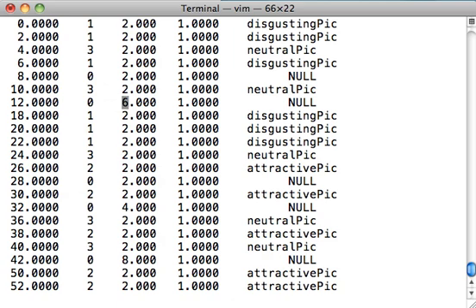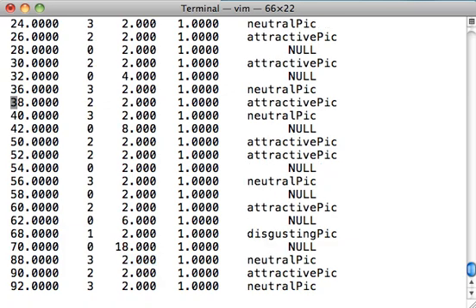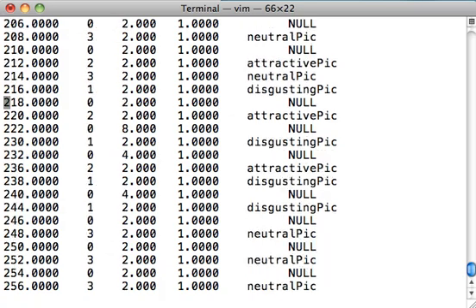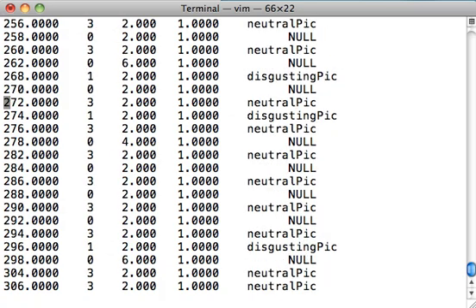This is just a null condition that fills in all the space between your events of interest, when there is some time between them. You'll notice that sometimes the null regressor will occur for more than 2 seconds. It can be 6 seconds. It can be up for 4 seconds or 8 seconds. So it doesn't have to be 2 seconds like the rest of these other regressors. It's trying to randomize the order of these in order to make the most efficient design possible.